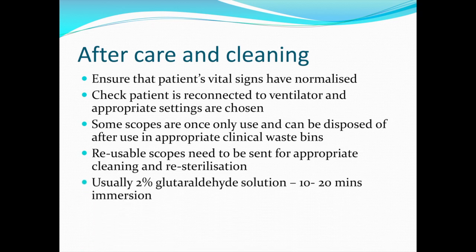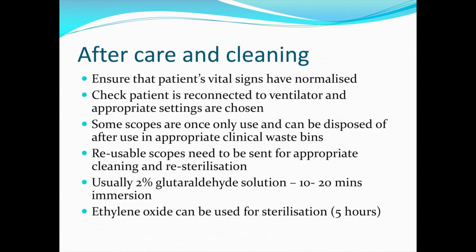Usually, a 2% glutaraldehyde solution is used, and the scopes are immersed in there for 10 to 20 minutes for cleaning, and then for sterilisation, ethylene oxide can be used, and this usually takes about 5 hours, but can differ depending on your local hospital and the cleaning and sterilisation guidelines for your reusable scopes.